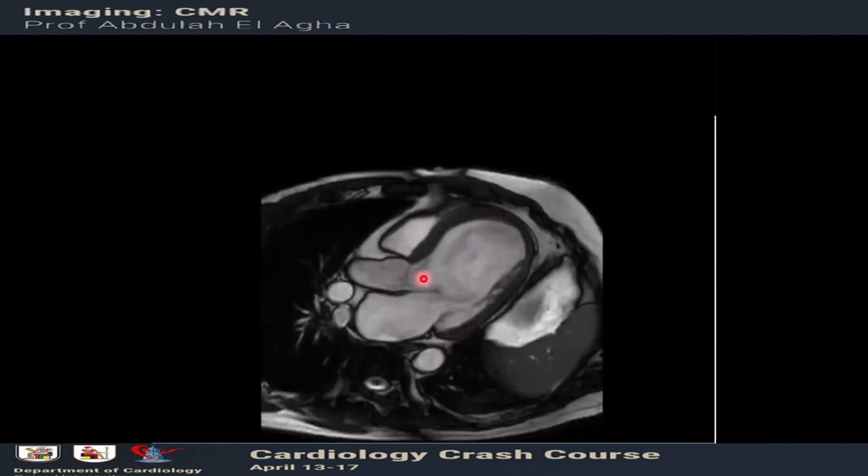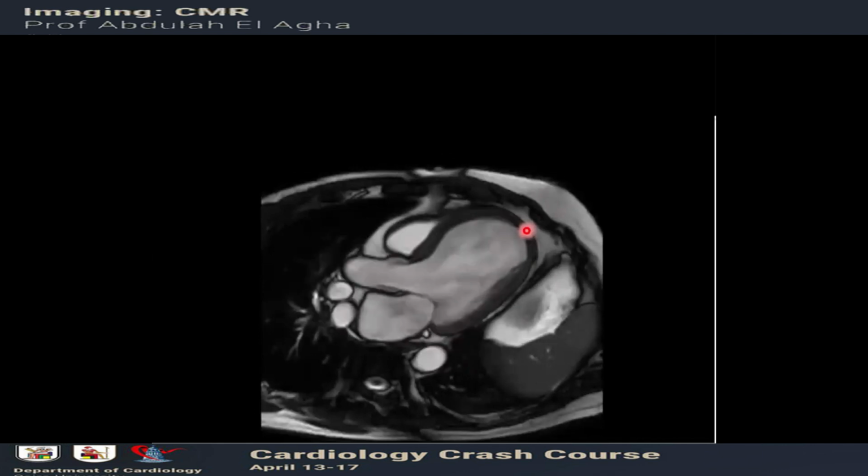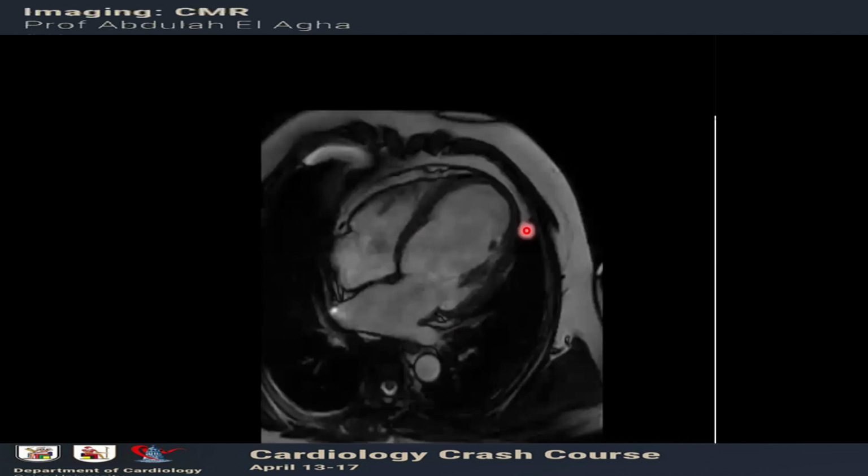In MRI, in CINE, this is the SSFP, you can say CINE SSFP. So when you have a tracing like this in the exam, you would say three-chamber view, CINE SSFP view showing akinesia of the whole anteroseptal wall. Okay, so this is a four-chamber view, same thing.